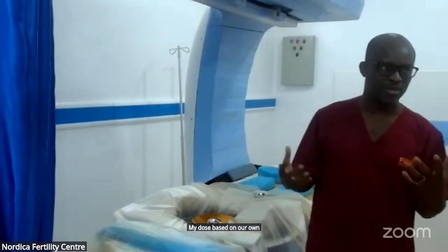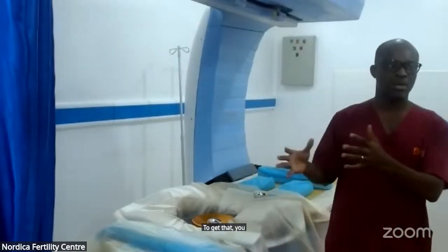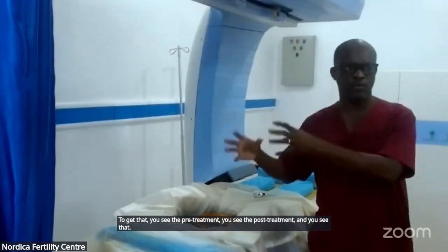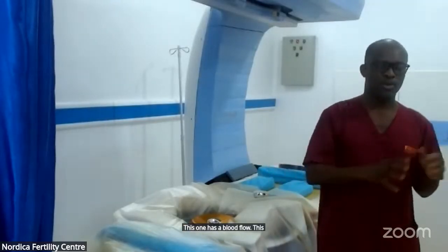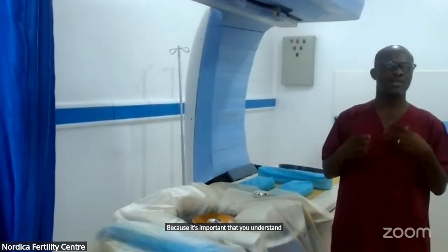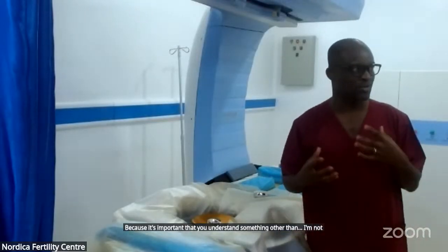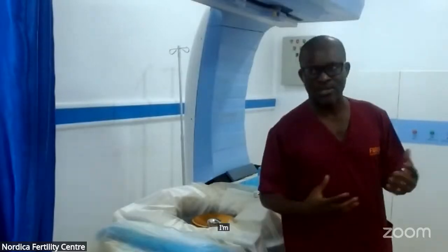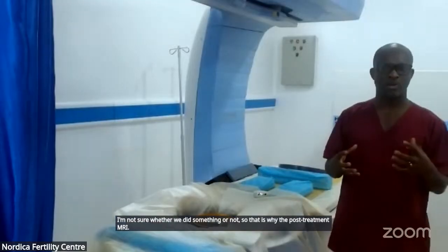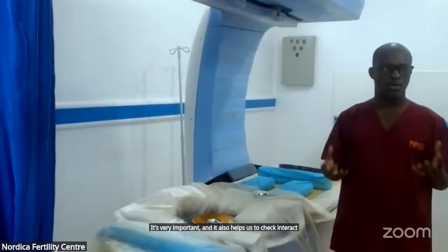We will both see it together: you see the pre-treatment MRI and the post-treatment MRI, and this one has blood flow while this one does not. It's important that you understand this, so you are not left unsure whether we did something or not. That is why the post-treatment MRI is very important, and it also helps us check for complications.